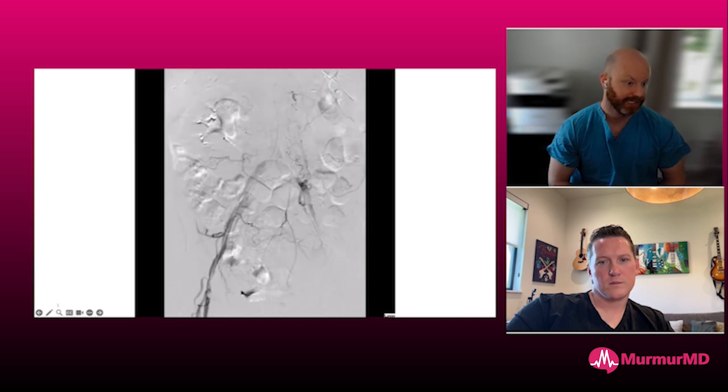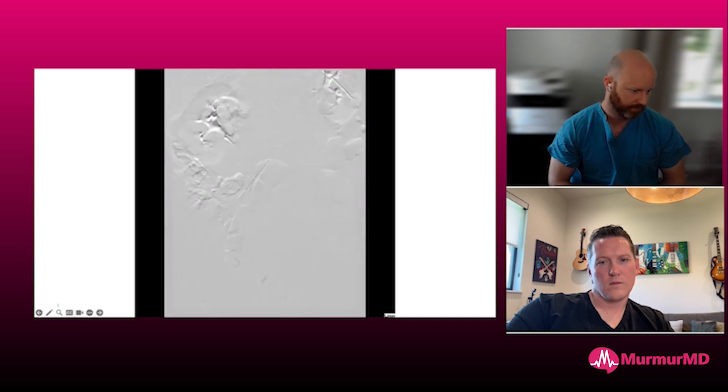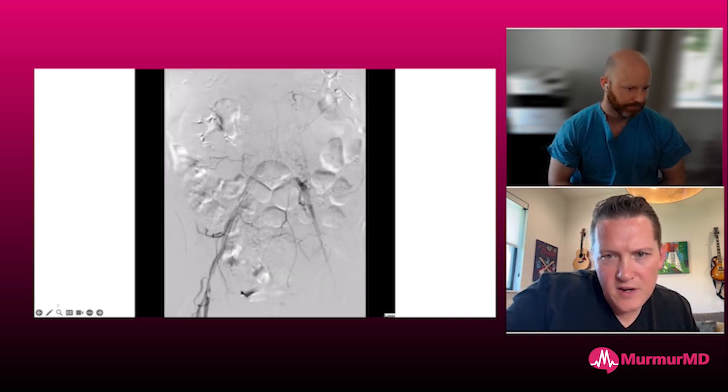And in this case, it allowed us to understand our revascularization as well, which I think is adequate and quite good. I mean, she went from no anterograde flow to anterograde flow. You can see on the left side, she still has a mostly collateralized flow. There is a small channel there on CT scan.